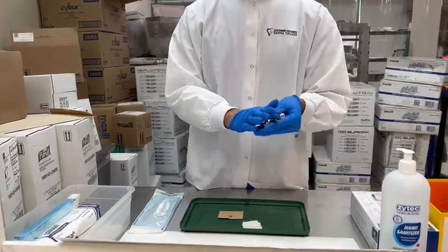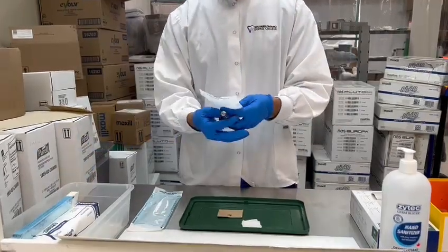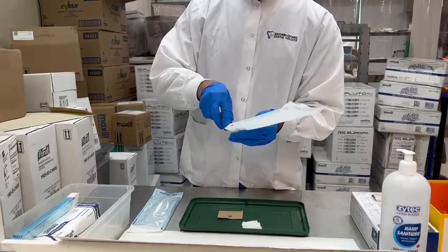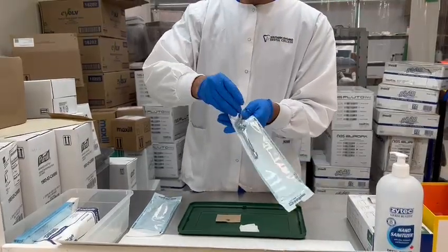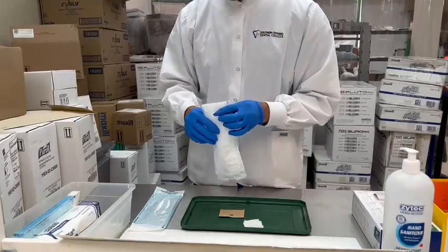We use a wipe to disinfect the syringe, then get a new sterilization bag. We bag the syringe in the sterilization bag, and then it can go into sterilization.